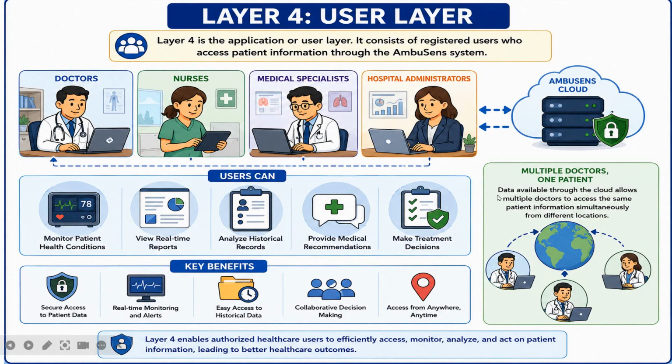Now on the right side you can see one of the important features of the user layer, that multiple doctors can access the same patient's information simultaneously from different locations. Since all the data are stored in the cloud, healthcare professionals can collaborate in real time regardless of their geographical location. This feature is particularly useful during emergencies, consultations, and specialist referrals.